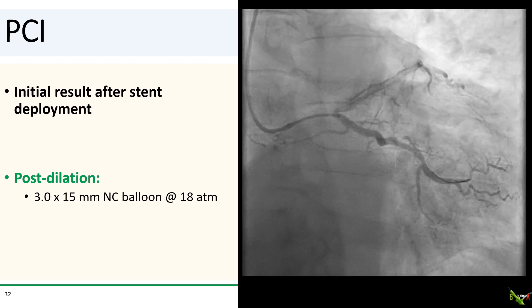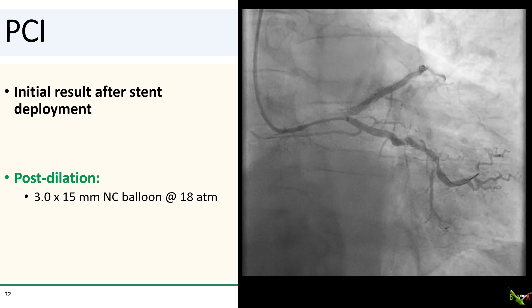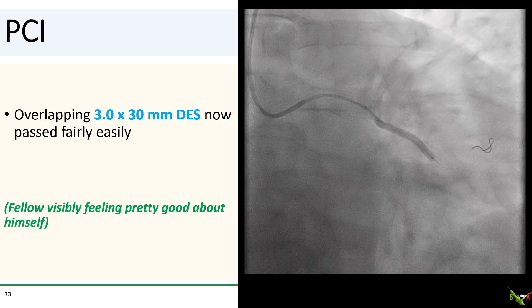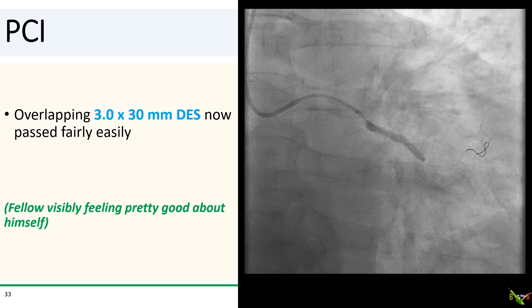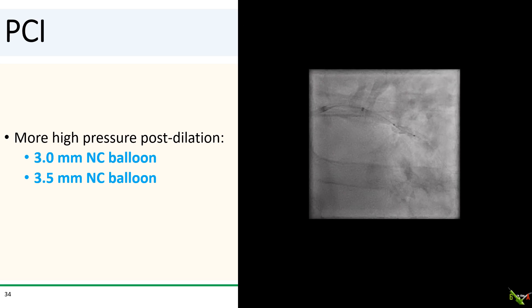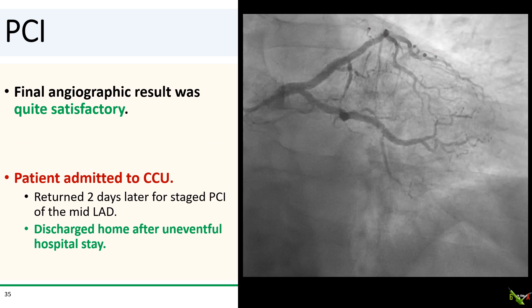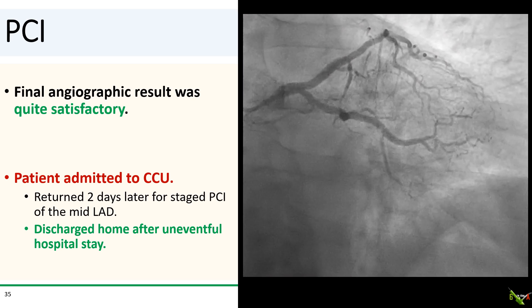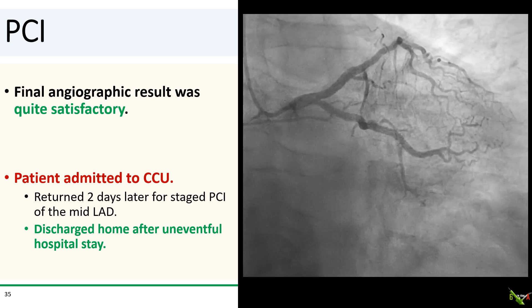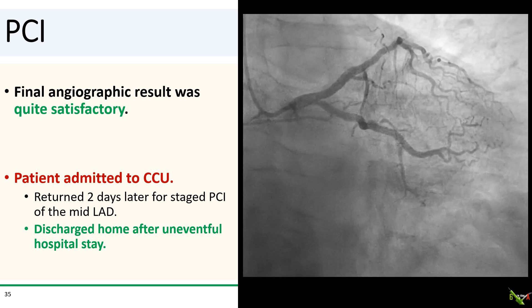Here's what things looked like after initial stent deployment. We next did post-dilation with a 3.0 by 15 millimeter NC balloon taken up to 18 atmospheres. After that, we passed and deployed an overlapping 3.0 by 30 millimeter stent fairly easily. We did more high pressure post-dilation with 3.0 and 3.5 NC balloons, and we got a very good final angiographic result, especially considering the alternative. The patient was admitted to the CCU and did well. He returned a couple of days later for staged PCI of the mid-LAD and was discharged home after an uneventful hospital stay.